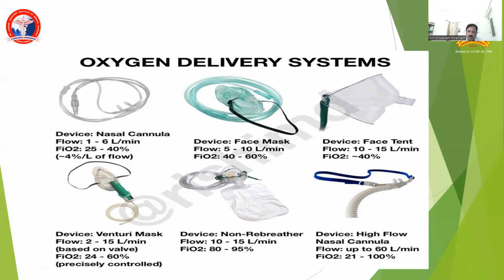However, if oxygen saturation is not maintained with a non-rebreather mask, then we can go for the high flow nasal cannula.